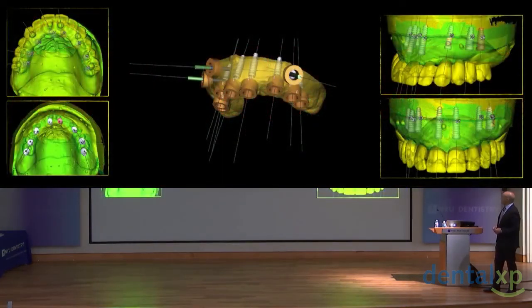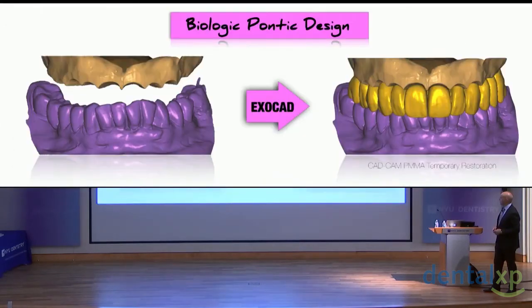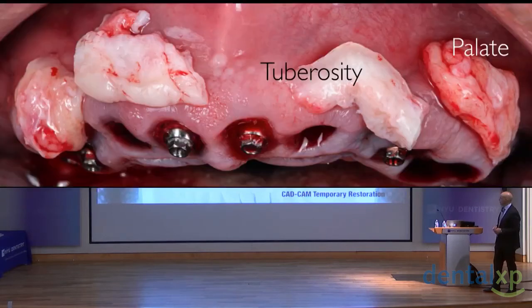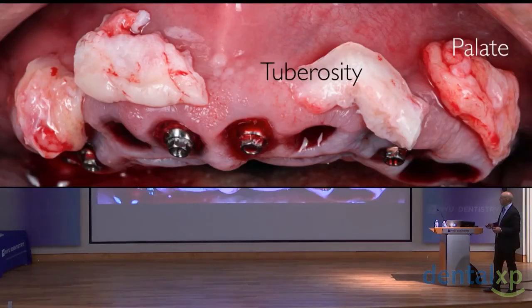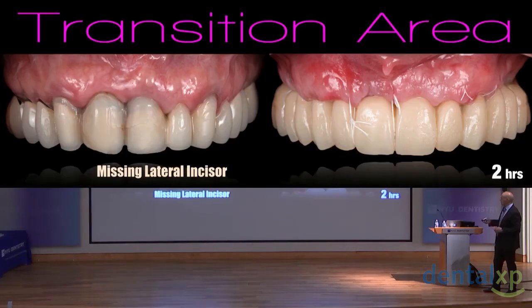And it works with a full arch also. I can plan digitally, I'm doing this lately, with a CAD-CAM temporary restoration. The philosophy is absolutely the same for one implant or several implants, with several grafts from the tuberosity and, of course, the palate. And you see the missing lateral incisor here. After 2 hours of surgery, you get this result.